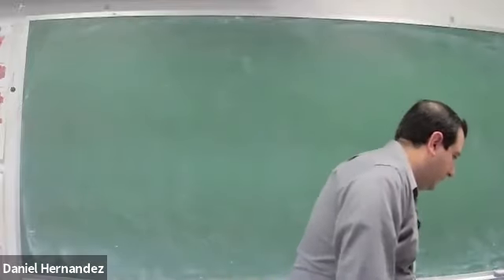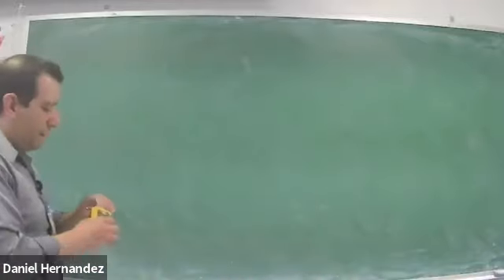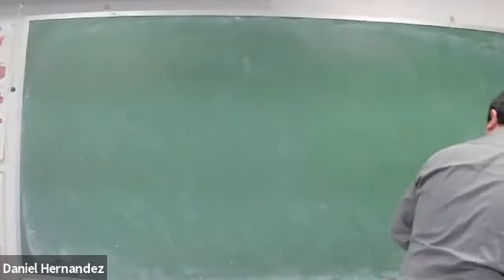So the three main pathologies that we're going to cover are going to be appendicitis, intussusception, and pyloric stenosis.